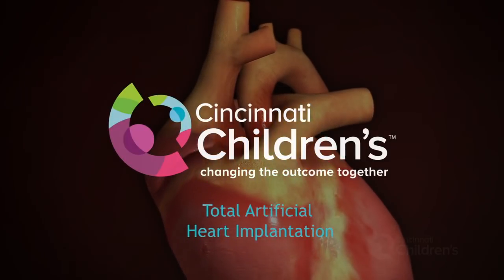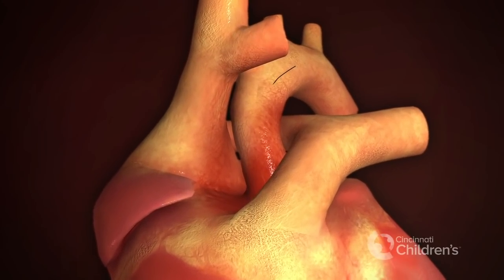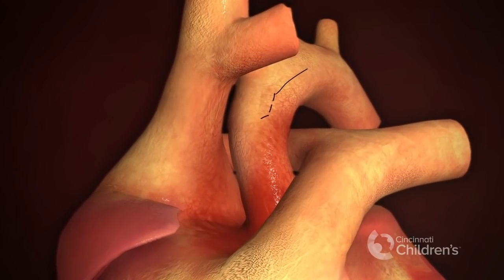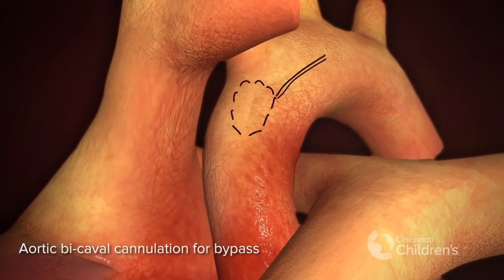Total artificial heart. Cannulation for bypass.